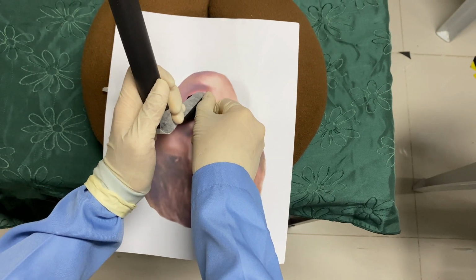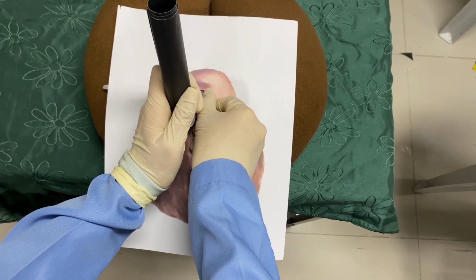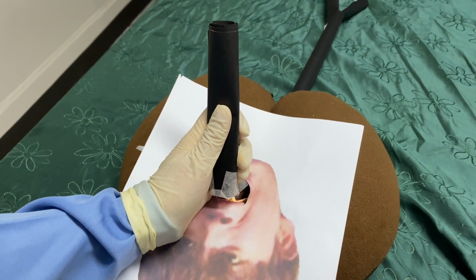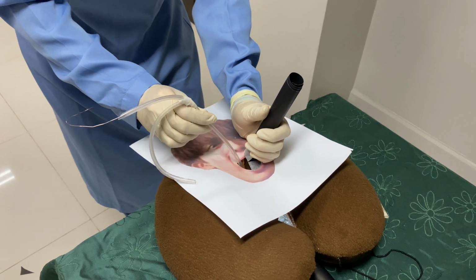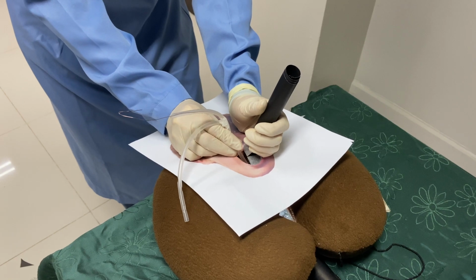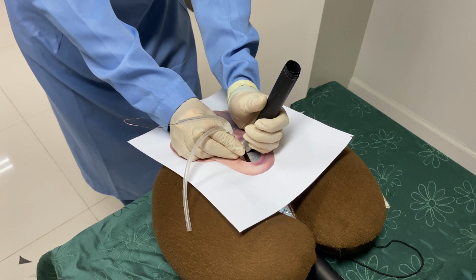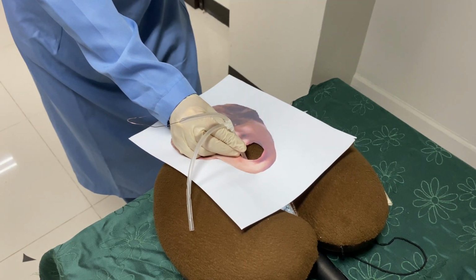Hold the laryngoscope with the left hand and insert the blade along the right corner of the mouth, sweeping the tongue to the left. Advance the laryngoscope towards the vallecula until the glottis opening is visualized. With a pencil grip, insert the endotracheal tube at the right corner of the mouth and guide the tip towards the glottis opening. Advance the tube further by increments of 2 cm until the cuff is about 3 to 4 cm beyond the vocal cords. Once in position, remove the laryngoscope.